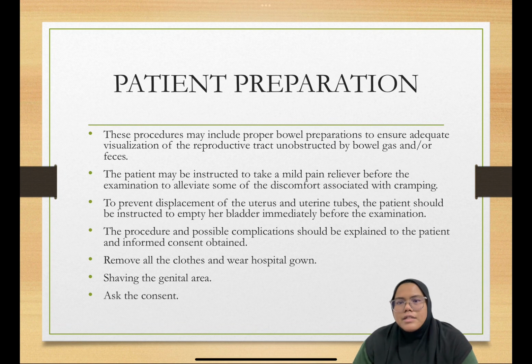Next, this is the patient preparation before doing the procedure. First, this procedure may include proper bowel preparation to ensure adequate visualization of the reproductive tract, unobstructed by bowel gas or feces. The patient may be instructed to take a mild pain reliever before doing this procedure.